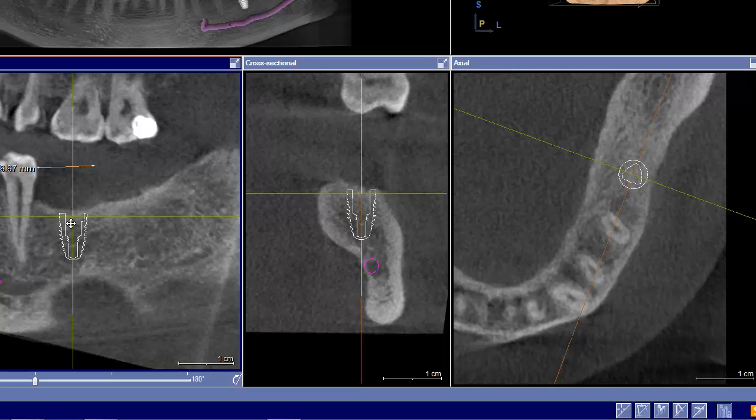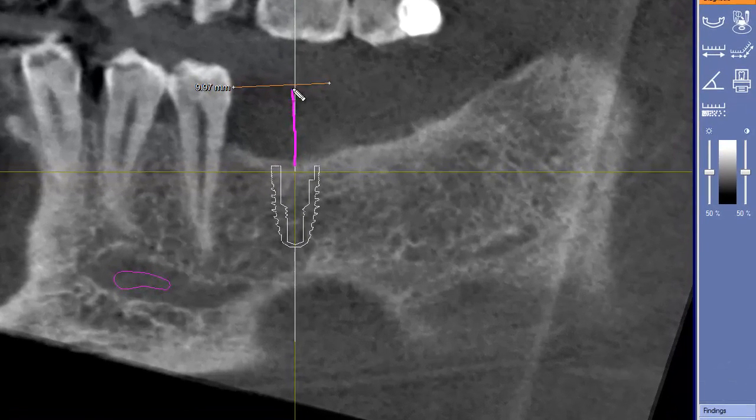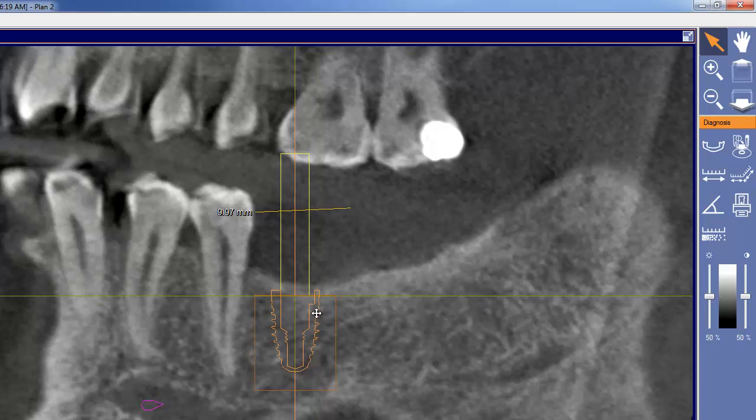And we'll use this as a basic centering line. What we're able to see here is if we follow this line right here, our implant is much to the distal of this line. Our implant should probably be somewhere in that ballpark right there. This is not the most accurate way, but certainly it's better than nothing, and it does a very good job of illustrating the point. So again, we definitely want to have the implant more centered. In this case, we would simply move the implant over to about right there, and that's probably a more appropriate mesiodistal positioning of the implant.